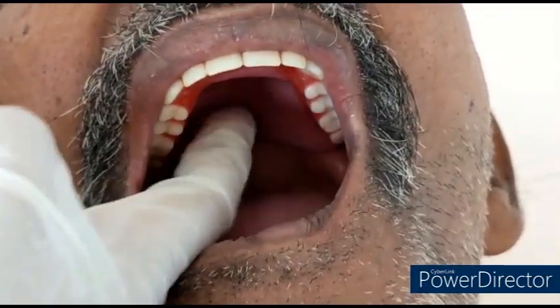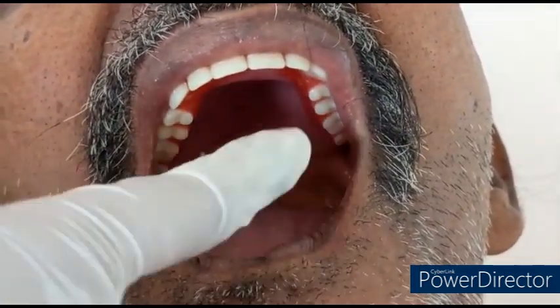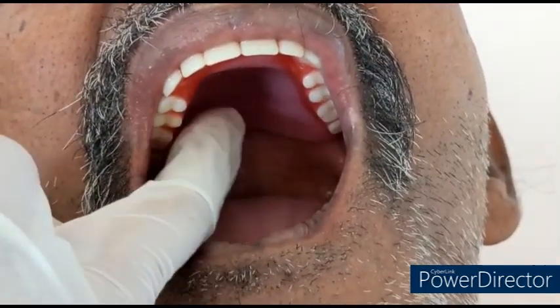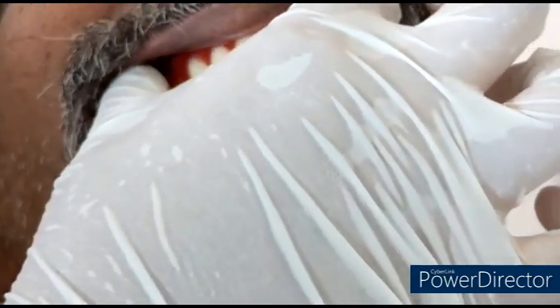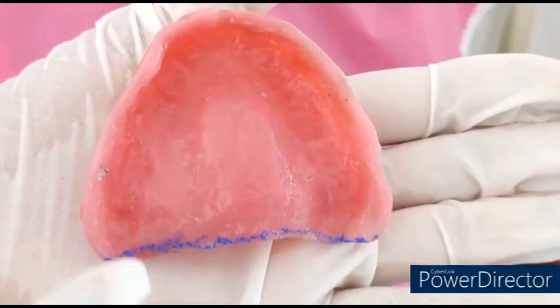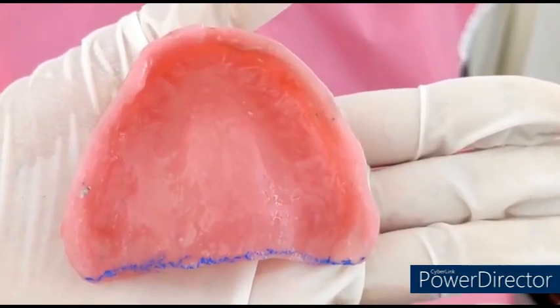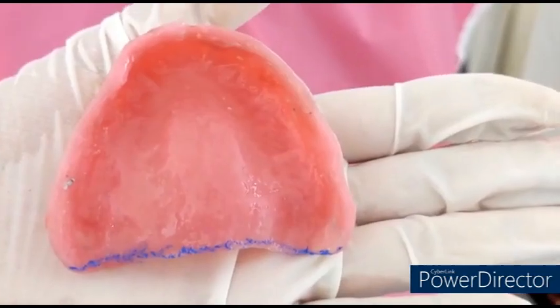And pressing it in the posterior region so that the PPS, the line which I have marked, will be reproduced on the posterior surface of the upper denture. So after a few minutes I am removing the upper denture. Now if you see, the line has been reproduced in the upper denture. So this shows that the posterior extent has been correctly recorded in the secondary impression, and there is no need for correction of the posterior seal area.